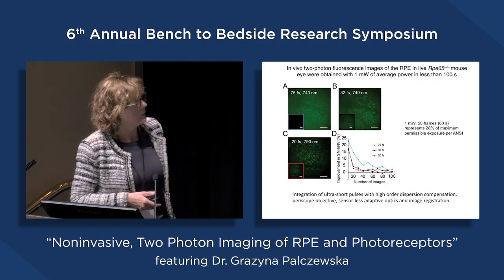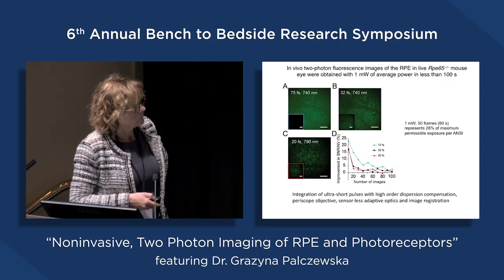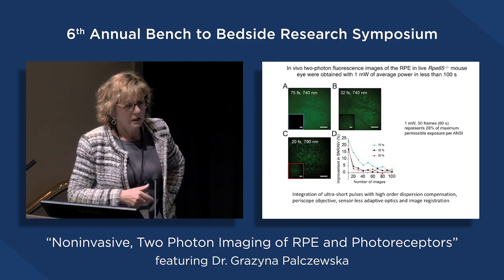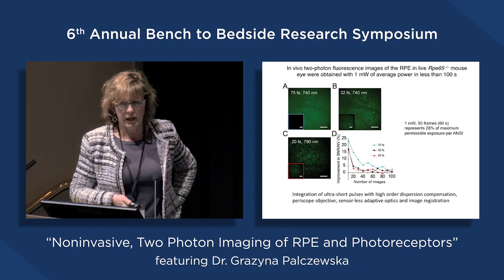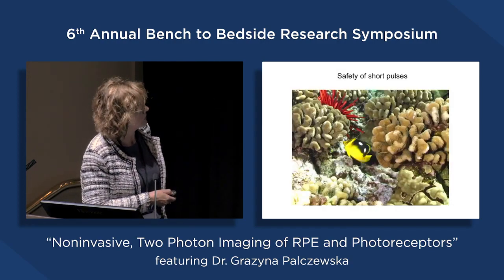This averaging and alignment is extremely important because during 100 seconds of the imaging, the mouse would be breathing and the heart would be beating, so there will be some movement in these images.